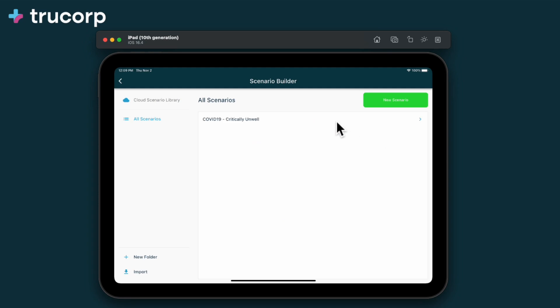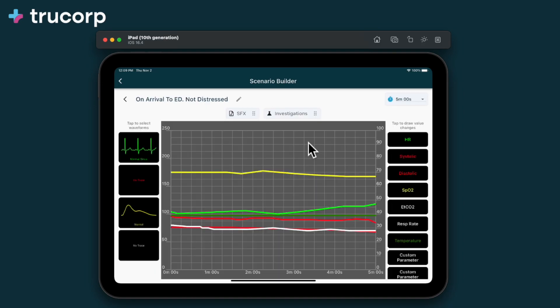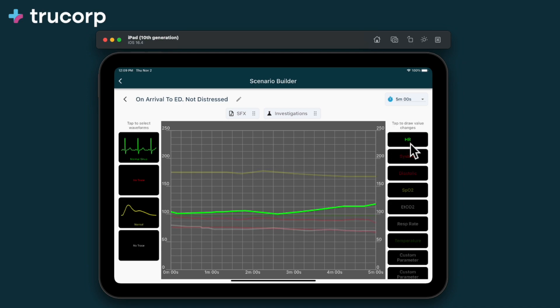Clicking into the scenario shows an overview of the scenario and what steps it contains. Each step represents a change in vitals over a set time. This step lasts for 5 minutes. The chart shows the change in each of the vital signs across the duration of this scenario step.